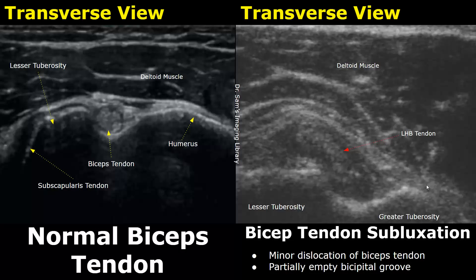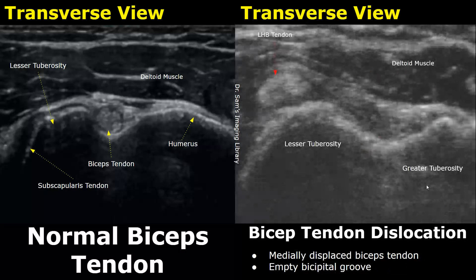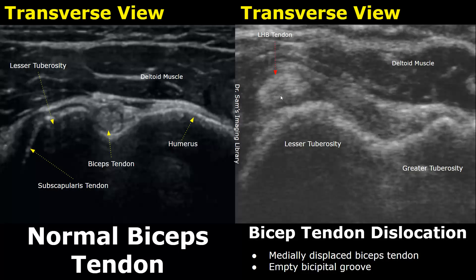Here is a case of biceps tendon dislocation. There is complete displacement of the biceps tendon — it is medially displaced and the bicipital groove is empty.